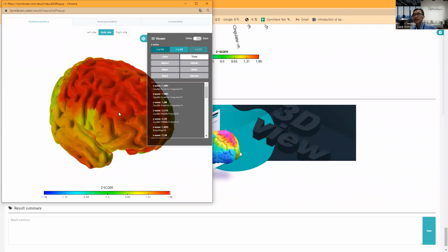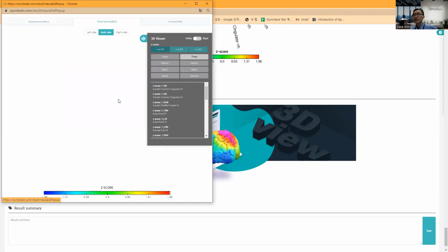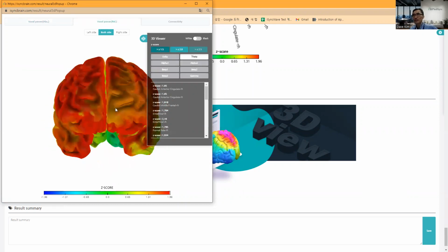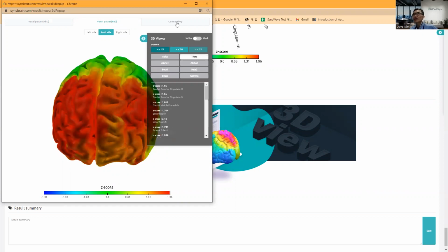In the theta activity and in the relative power, we can also see the relative excessive area in this frontal area, especially in the theta band. We can also check where the most excessive area is, like this. This is the list of the most excessive areas, and we can use another criterion.